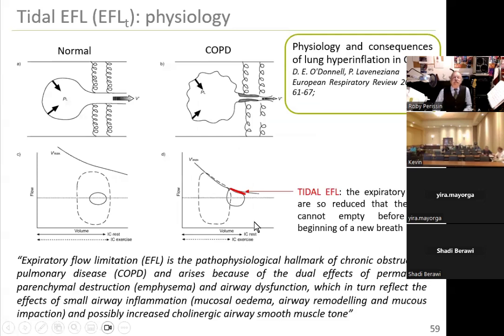Having said that, when you ask a patient to perform a flow volume loop, a spirometry, if they can, it will be for them like blowing through a straw. So the maximum flow will likely touch their normal tidal breathing. This is the typical spirometry that you see, even with very sick patients: they blow, blow, blow, and that's what they can do.